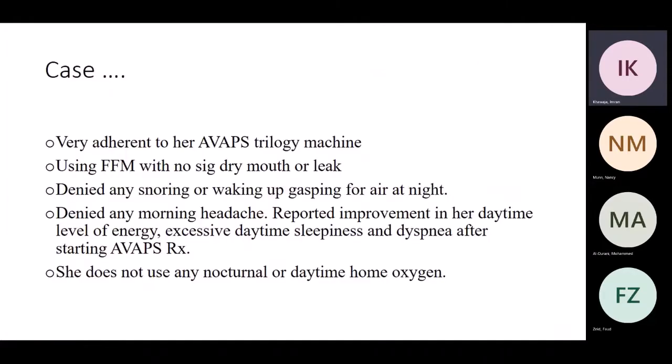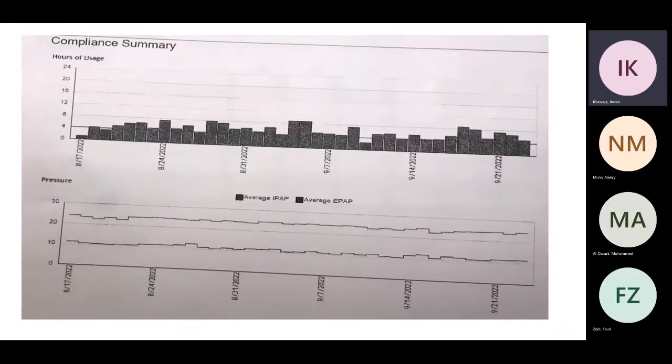And if you see in this diagram, since the sleep apnea or whatever, the upper airway was maintained open at an EPAP of 10. So that means the machine, maybe it's lower than that. She may need pressure support. No, I think it's the machine. The reason that it picked 10 and kept it around 10 is what it takes to keep the upper airway open. Okay. But the problem is because you made the pressure support maximum 14 on this prescription, this is why the IPAP didn't go beyond 24. And I will tell you, this is an insufficient response.